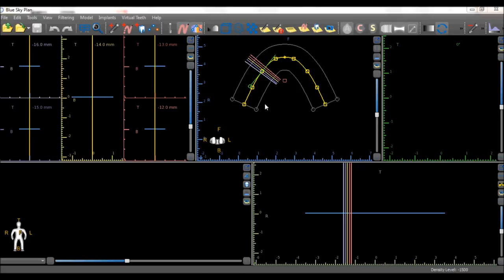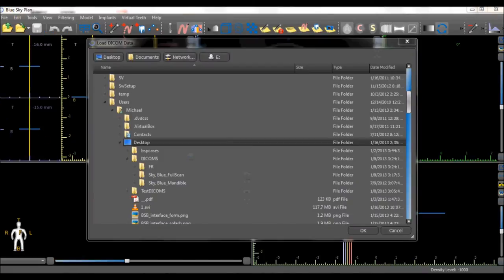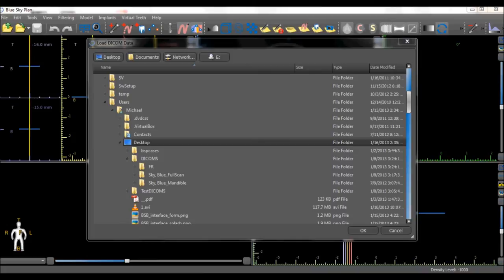To load a new set of DICOM images, go to File, New, Project. A dialog box opens, displaying the folders and files in your computer.